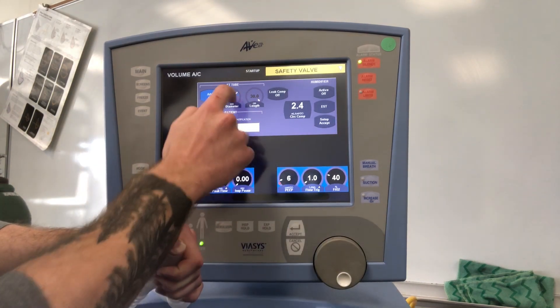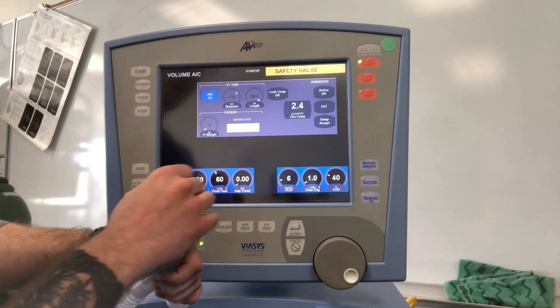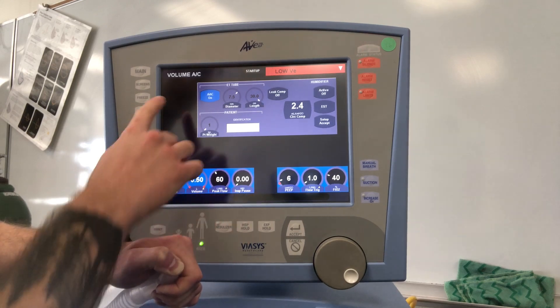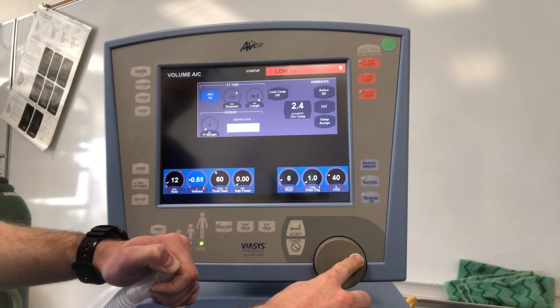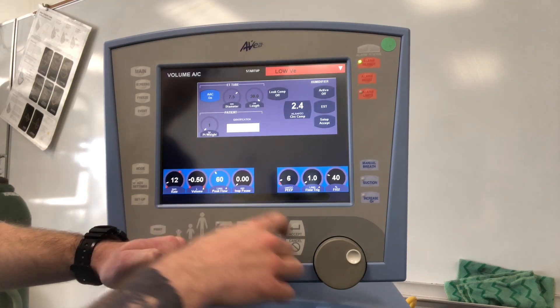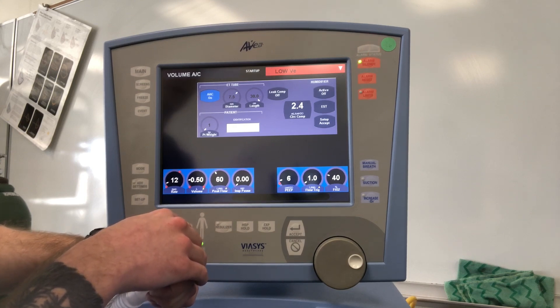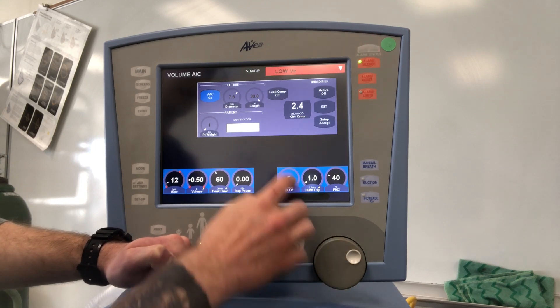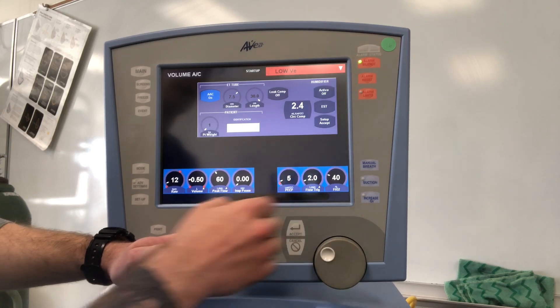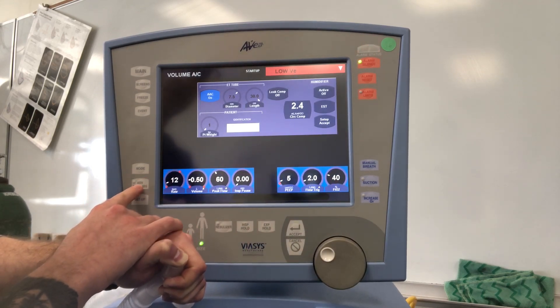We can change our tube size and length, and enter patient weight and identification if applicable. After putting in initial settings, hit setup accept. Right now we're in volume AC. We can adjust our volume here in liters, our rate, our peak flow, and I-time. Inspiratory pause — we recommend keeping that at zero. PEEP can be set at five. We recommend setting your flow trigger around two to start, then titrate to your patient. FiO2 is here, then we'll go to advanced settings.